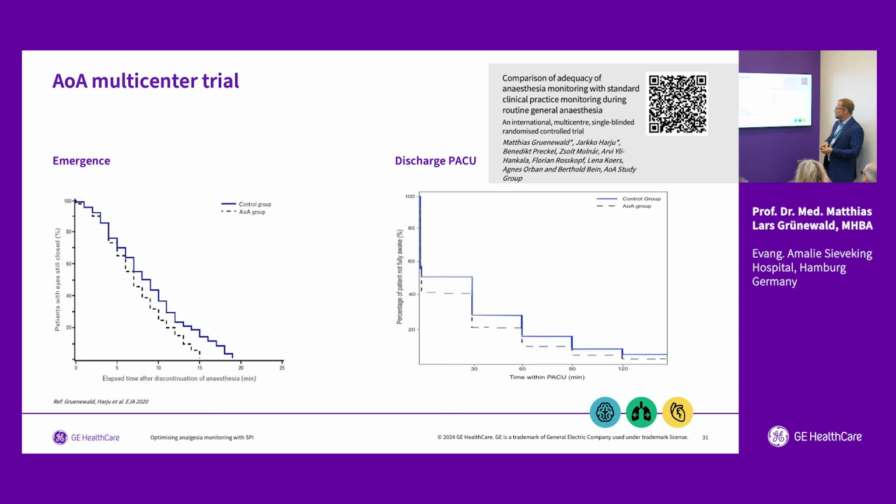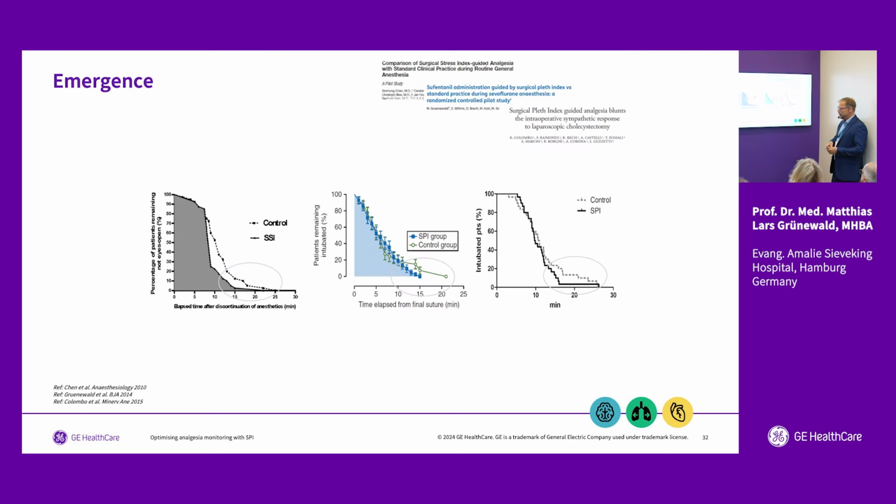But again, what we could show is the emergence was much more predictable in the group that used such monitoring. And this was not only by waking up from the anesthesia procedure, this was continuing when looking at patients at the post-anesthesia care unit, where patients were also readier to be changed and sent to the normal ward much earlier than in the control group. And this phenomenon can be shown by many, many studies that look now at monitoring. You have a much more predictable wake-up time when using those monitors. The percentage of patients that have long periods of waking up is really dropping down big time.